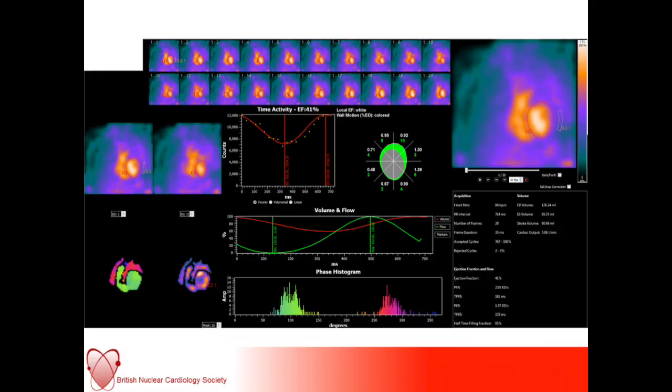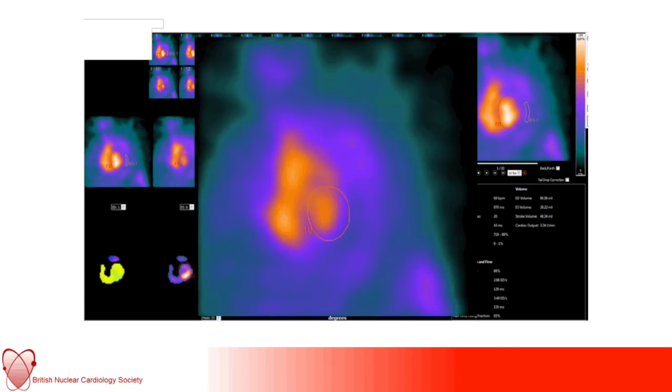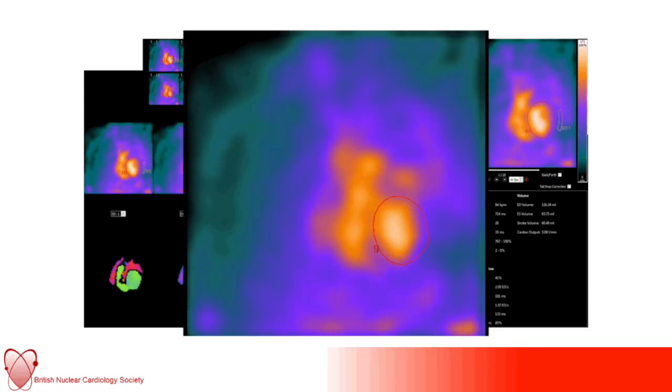Here is an example of the output that the computer software might demonstrate: serial panels of the cardiac cycle, phase and amplitude images and their histograms, a panel showing where the region of interest around the ventricle was drawn, the background, regional wall motion abnormalities on a radial plot, and the ejection fraction. Here's a normal ejection fraction measured at 68%. Compare that with this individual — a patient undergoing chemotherapy for breast carcinoma — whose ejection fraction is impaired, measured at 41%.